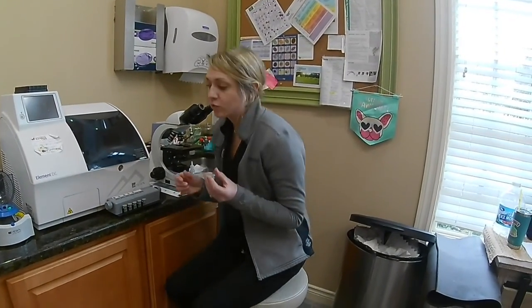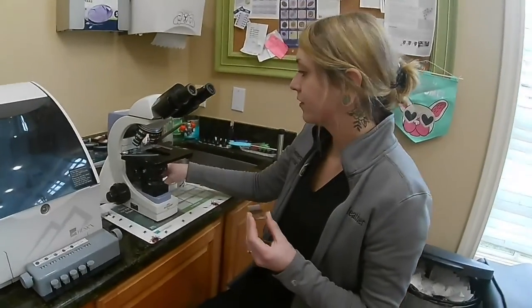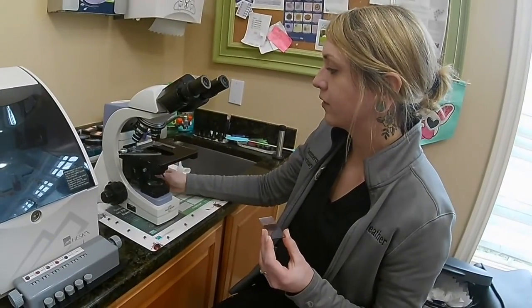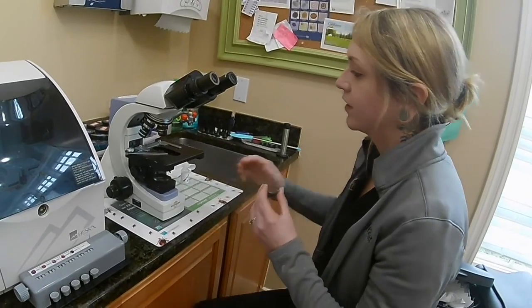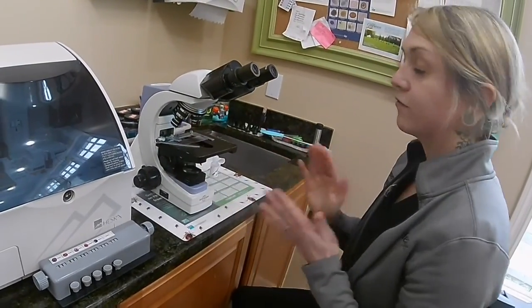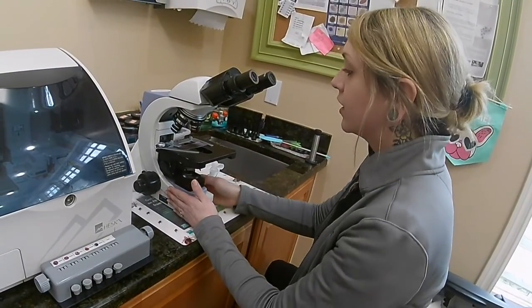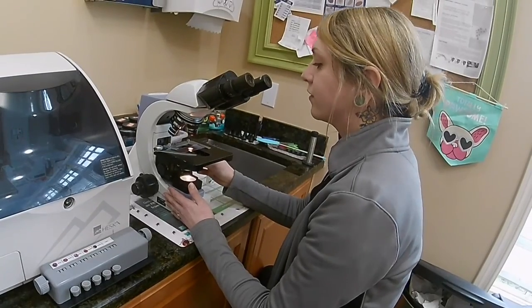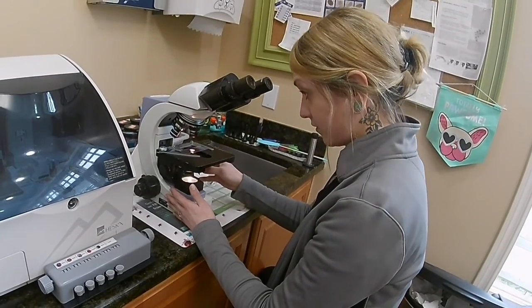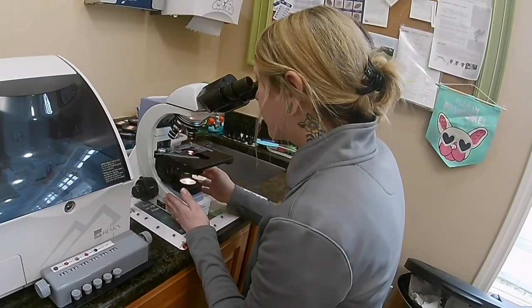Alright, so now on to actually reading the slide under the microscope. To start, I'm going to start on scanning. I'm going to have my microscope all the way down. We're just going to start right at the beginning here. The area that I'm going to be focusing on is that monolayer just behind the feathered edge there. But we will get to that point. Initially, I'm going to try to set up just to be in that relative area, but we'll get there.